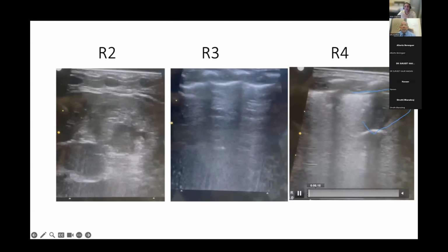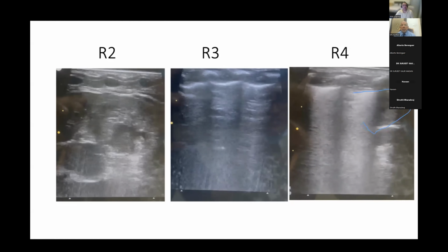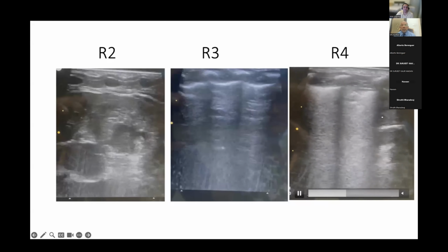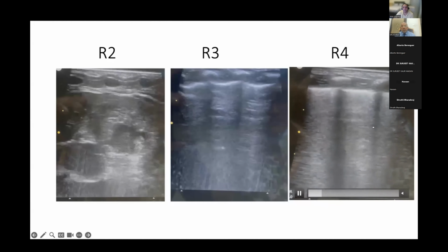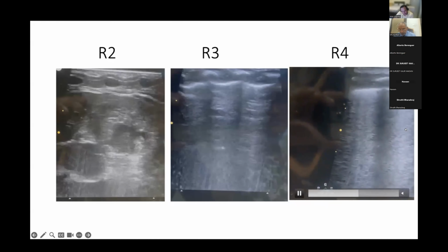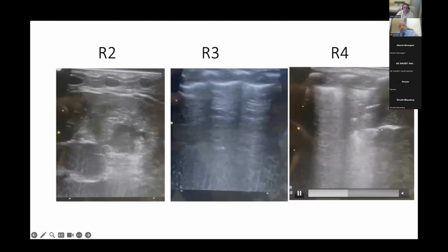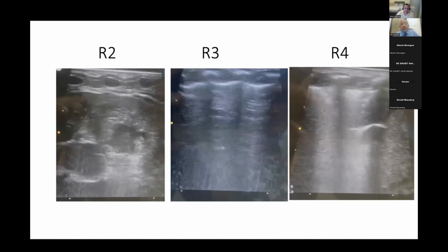Okay, so it's a very nice image. Shruti, you want to describe it? Let me not steal your thunder. Go for it. Here we can see a little bit of hepatization and probably a collapse, with straight margins and some linear bronchograms? That's a linear air bronchogram that you see at the bottom. So again, this is a large lobar consolidation with atelectasis.